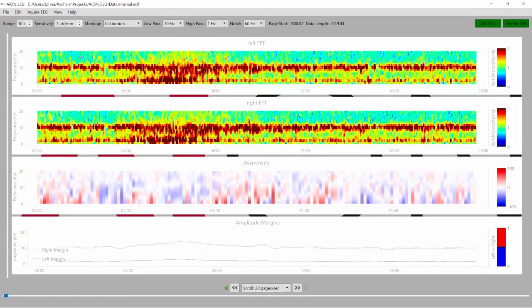Now, how can we use this noise reduction feature to improve other future features on an EEG machine? Another thing you can do with an EEG machine is calculate the trends of the brain data, so you can display pretty much an hour of EEG recording on just one single page.